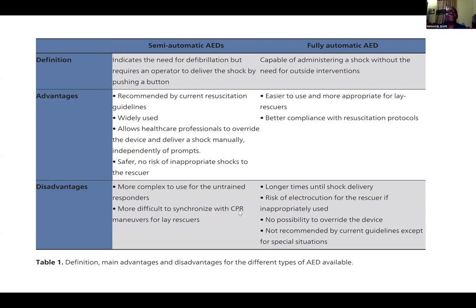Then the fully automated one is mostly used by bystanders. You don't require much, but the problem here is that when a bystander is doing CPR, it can give a shock, and the shock may coincide with somebody doing CPR at the same point. That is one of the disadvantages of that.